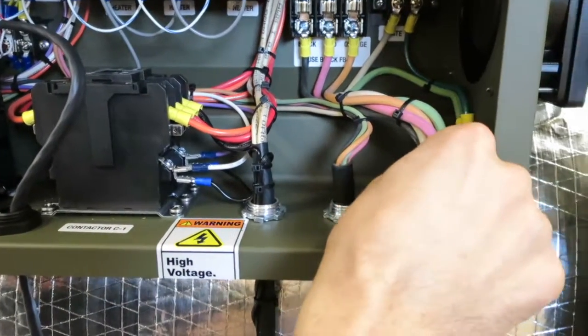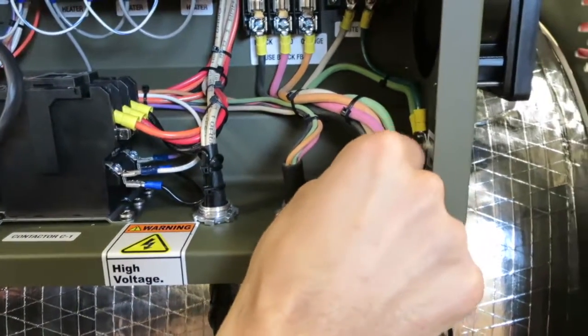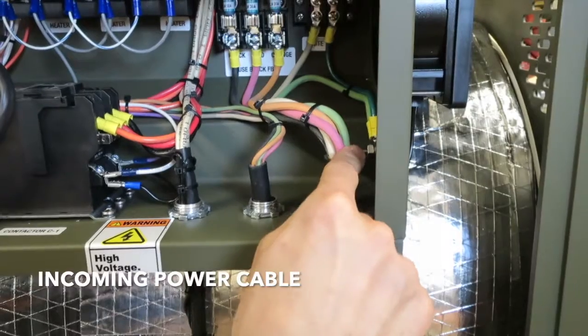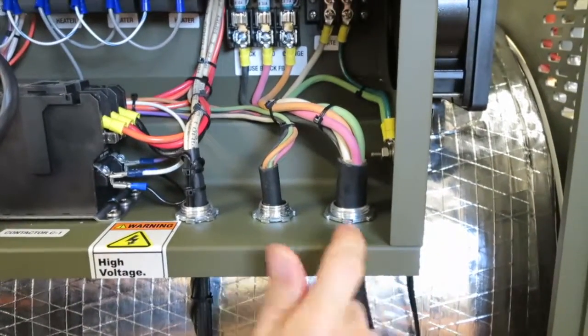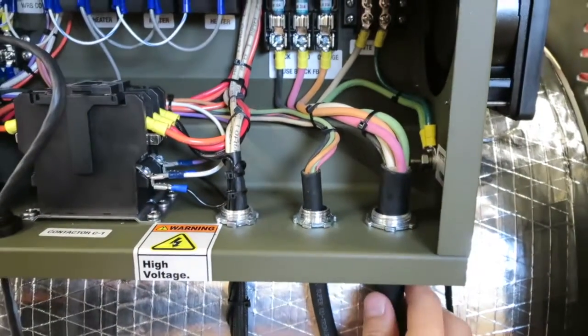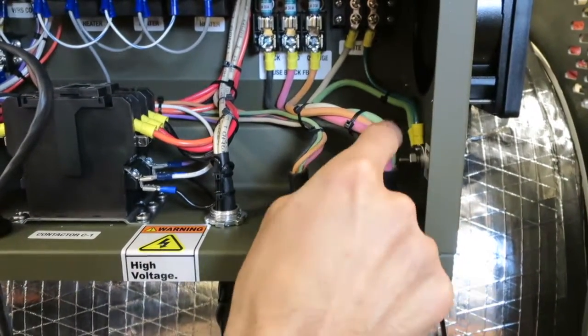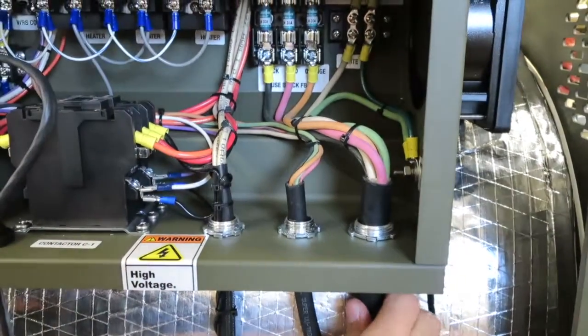Finally, on the cables, I have this large cable, which is the input power to the sterilizer main unit. So again, it's 3-phase 208, very high voltage in this area. You want to be very careful. Also have a ground and a neutral, so it's a 5-wire incoming power.